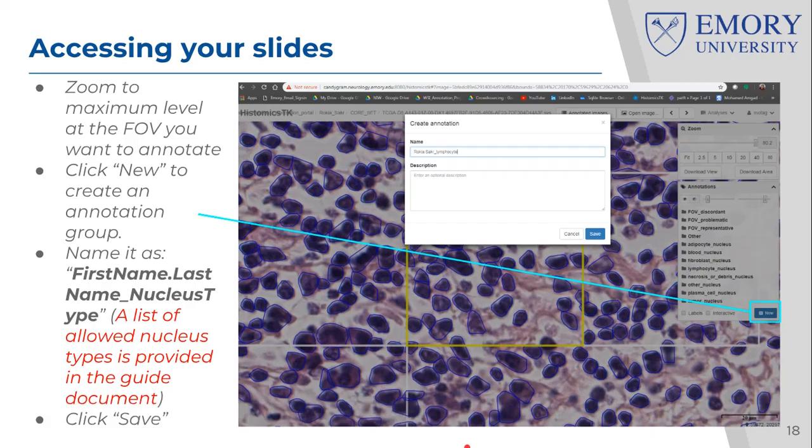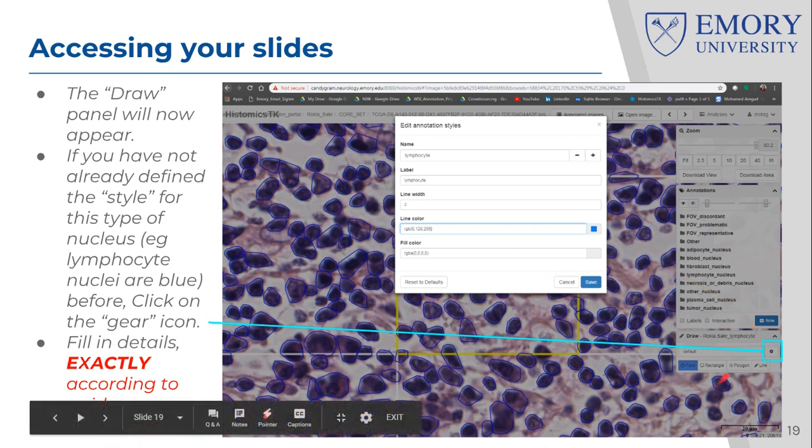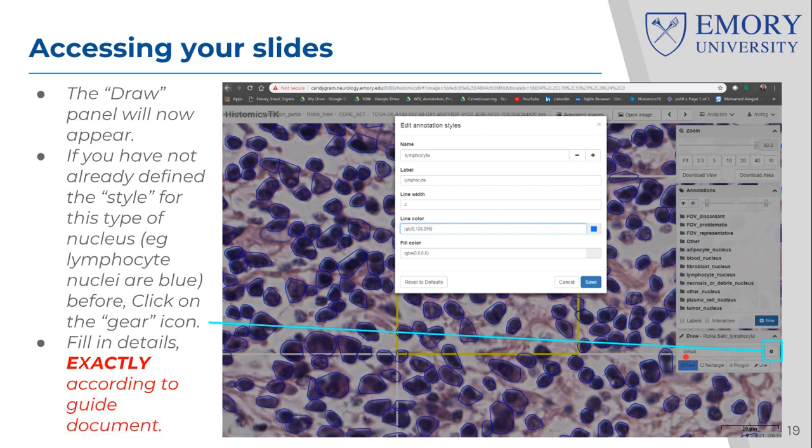But for having a smooth presentation, I'm just going to show it as if you're creating an annotation from scratch. This is also relevant for the senior pathologists who may need to create a new annotation style that is not really defined in the main document. But for everyone else, really, you should have the annotation predefined from the previous step. Okay. So, how do you define an annotation style?